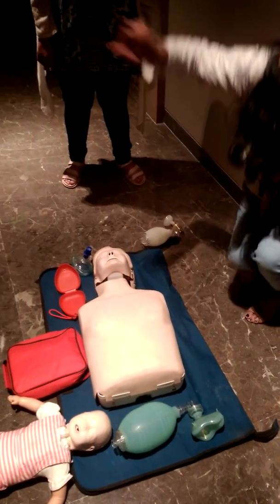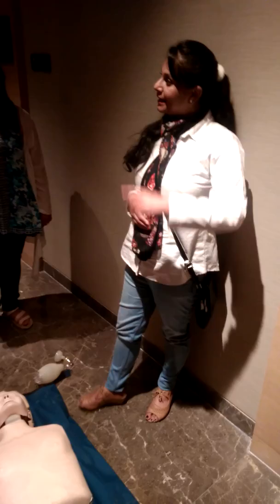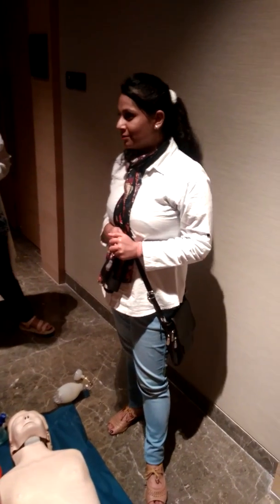Suppose I was the only rescuer and I was doing all this. In the meantime, before I used to get the CPR, I have already activated the medical system. Then the help will come. That person will come and will bring the AED.